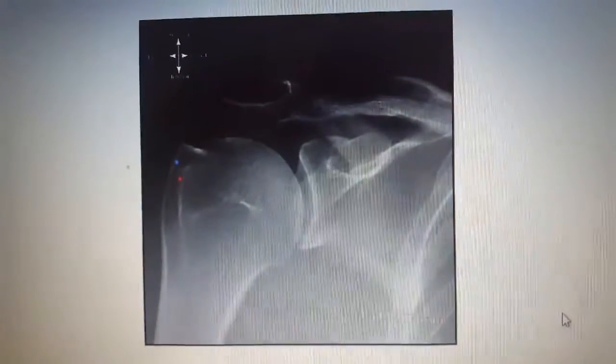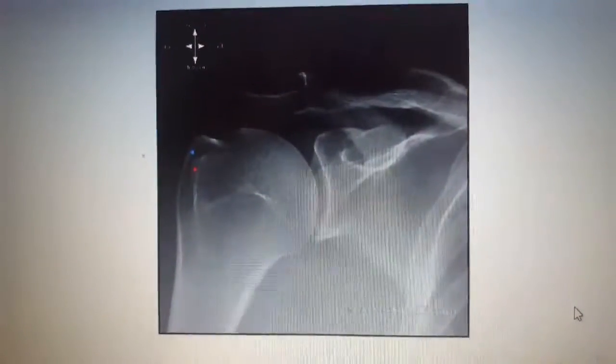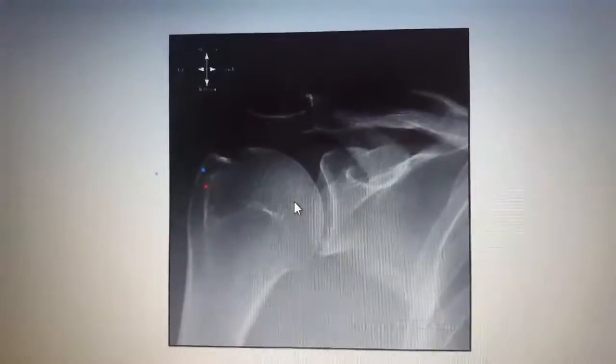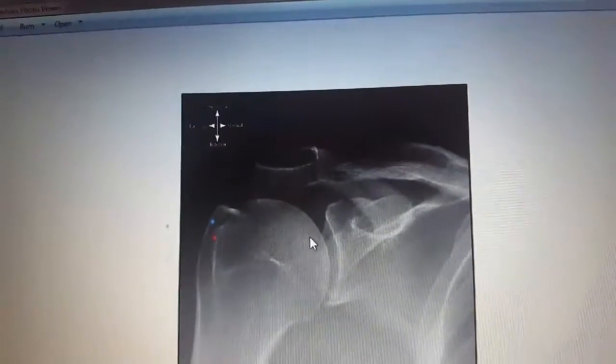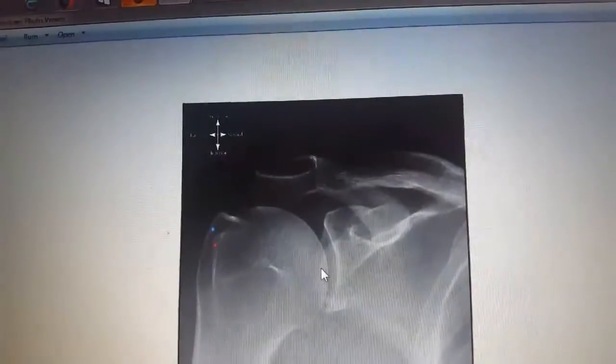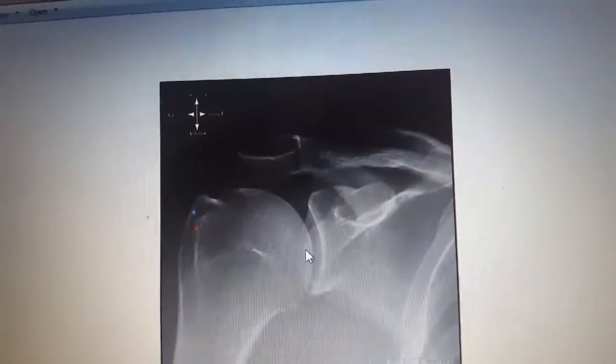For the second projection, which was the AP shoulder with external rotation, the evaluation criteria is the humeral head in profile. Let's see here. Also, the greater tubercle in profile on lateral aspect of the humerus, which is up here. And then as well as the scapulohumeral joint visualized with a slight overlap of humeral head on the glenoid cavity, which we could see here. And it's overlapping the glenoid cavity. And finally, it would be the outline of lesser tubercle between the humeral head and greater tubercle. Right here.